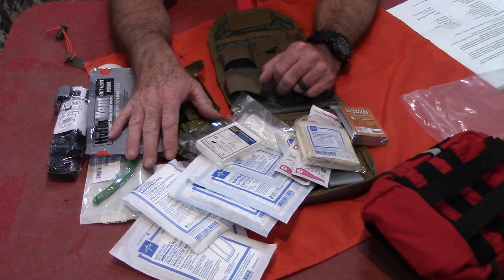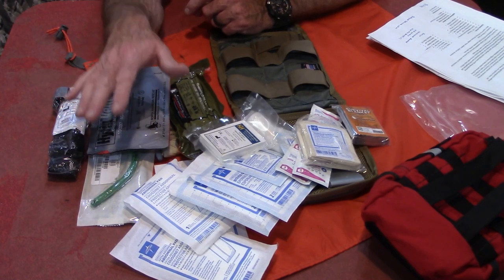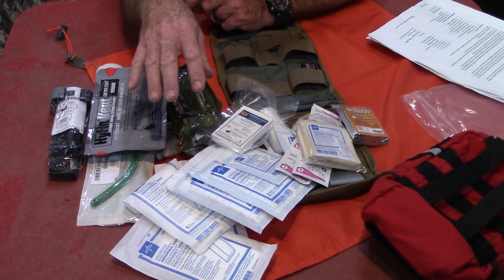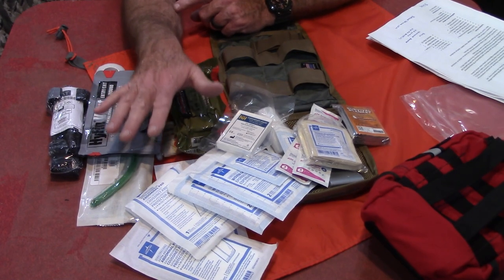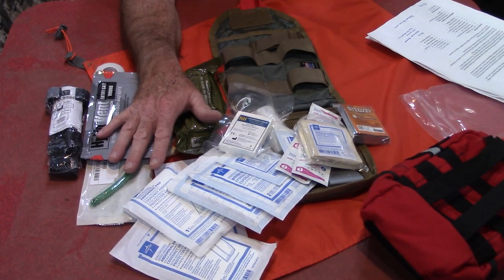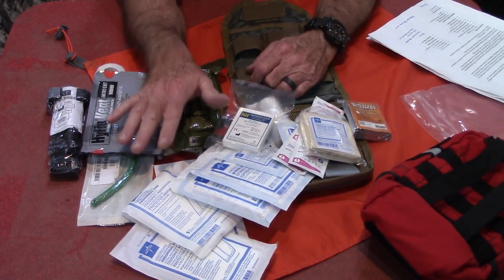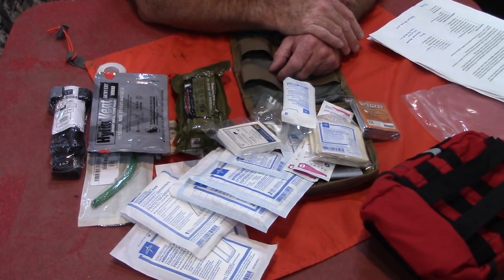That's everything in the Bear Fat from Refuge Medical. They also have a Bear Fat 2.0 now that includes eye shields and eye pad gauze. You can get additional add-ons as well — a decompression needle, different kinds of Quick Clot, and even a SWAT-T tourniquet. Now, a couple of really important takeaways about this kit: it is not a budget kit — $250 — but everything in it is 100% first rate. We're talking North American Rescue, H&H — all high-quality stuff.